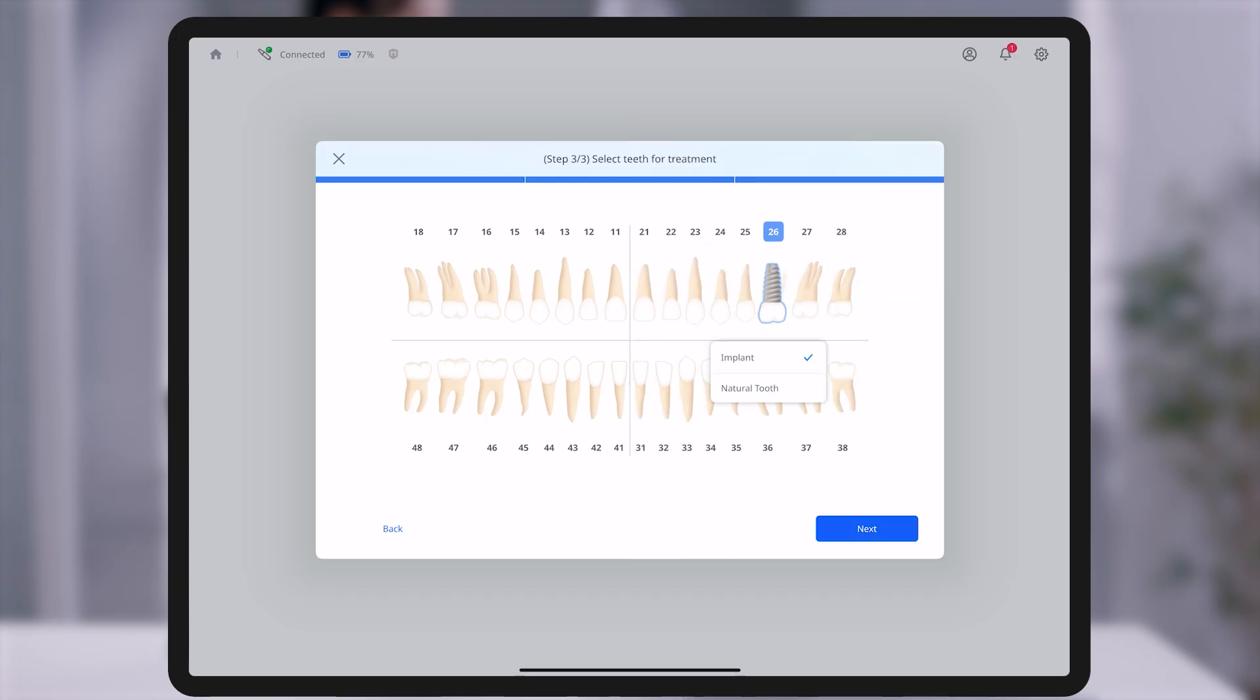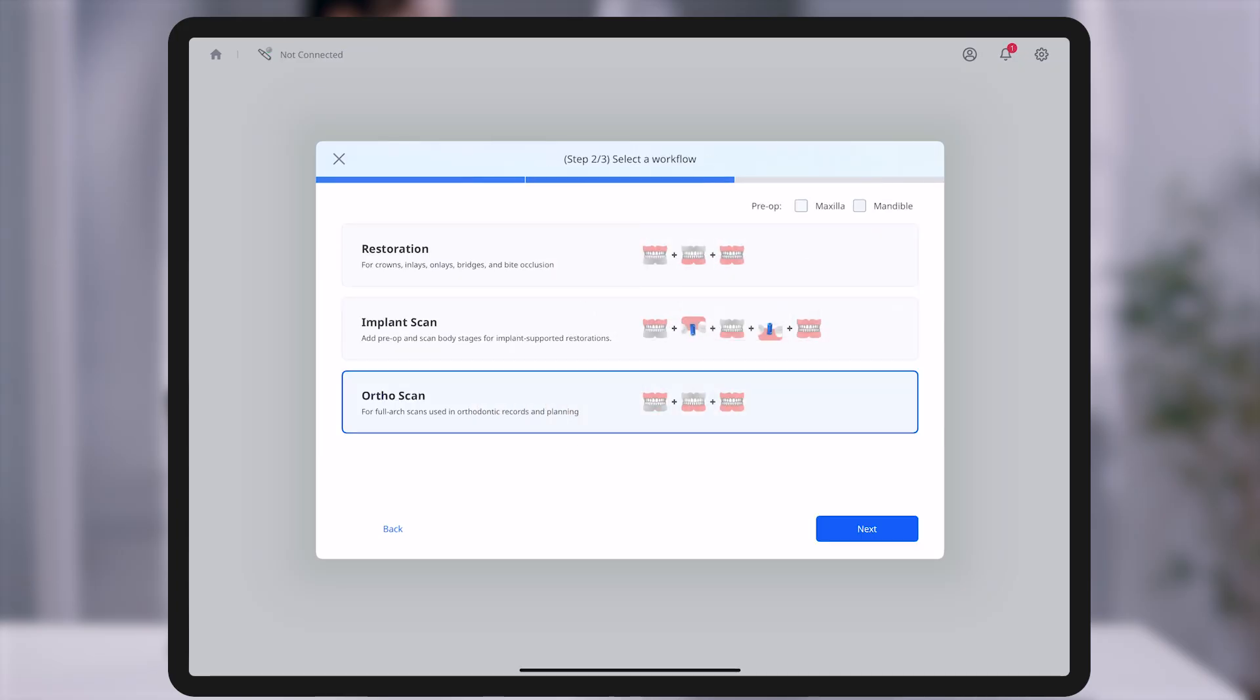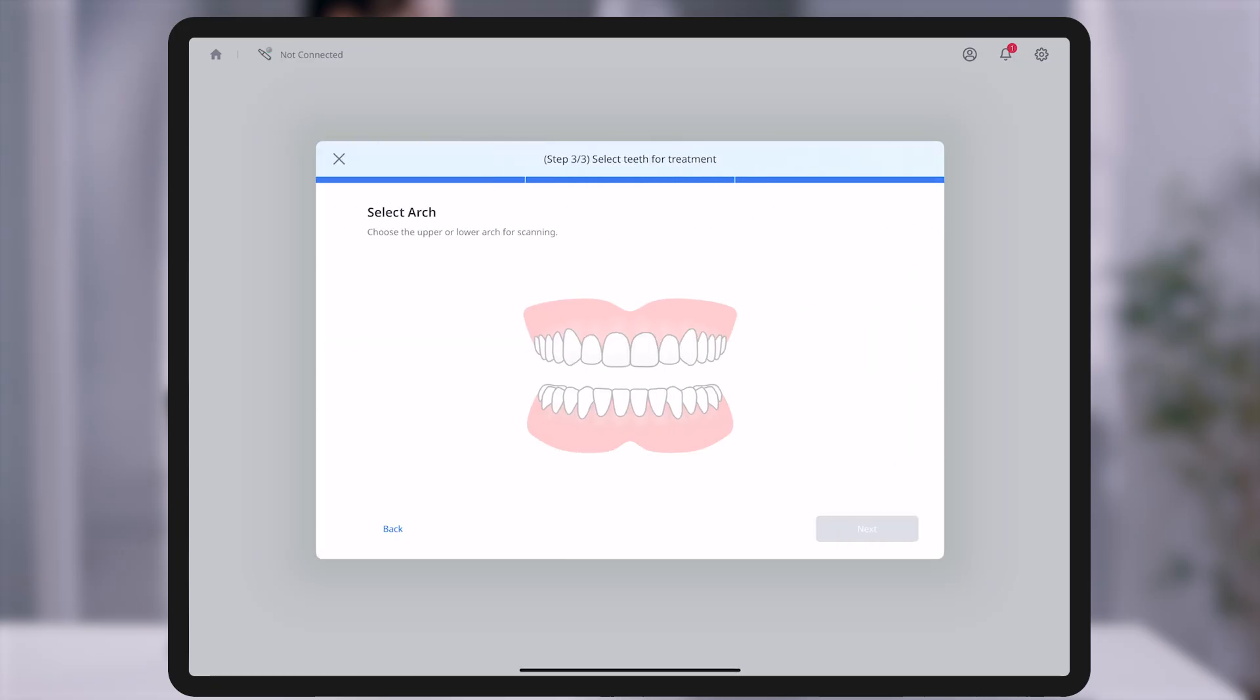For the implant workflow, each selected tooth can be marked as either a natural tooth or an implant. In the ortho scan workflow, selection is done by arch rather than individual teeth.